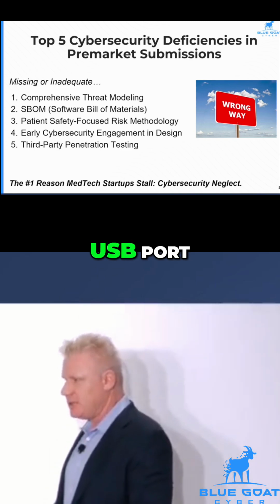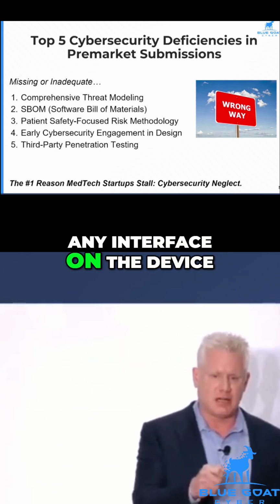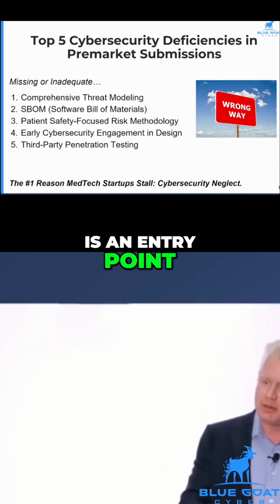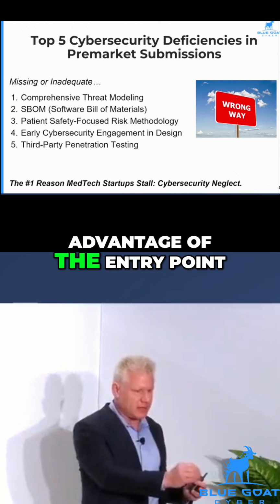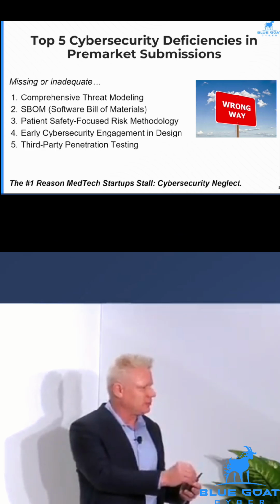It could be a USB port, it could be an HDMI port, it could be a serial port. Any interface on the device, logical or physical, is an entry point. And from a threat model perspective, we have to look at the threats and how they can take advantage of the entry point. If they get through it, what then can they do?